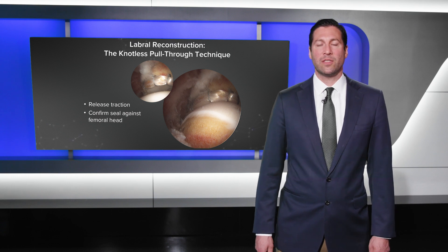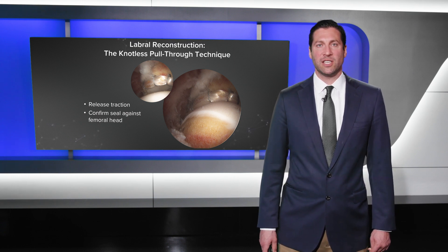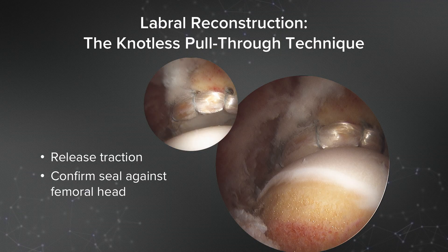It's important with the labral reconstruction using the knotless pull-through technique to evaluate the reconstruction by releasing traction and confirming the seal against the femoral head. That is seen before and after here on the right.